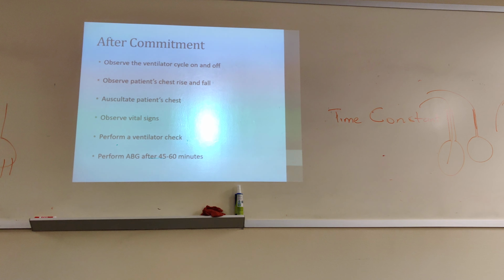And then, finally, you do a vent check. Please do a vent check, because if you don't do a vent check before you walk out of there, another therapist comes behind you and changes something, right? When somebody else comes, something happens to the patient, they say, well, where is the last vent check? Well, Kiara did it. Well, you had him on PEEP of 50. Well, that's not what you had him on. You had him on a PEEP of 5, but somebody else came along and changed it.